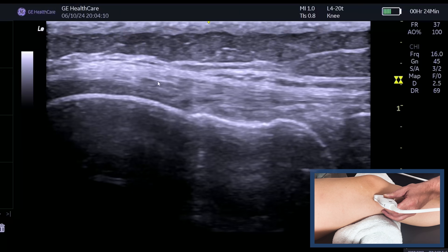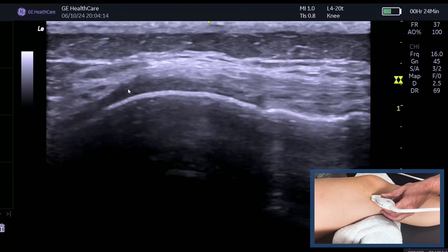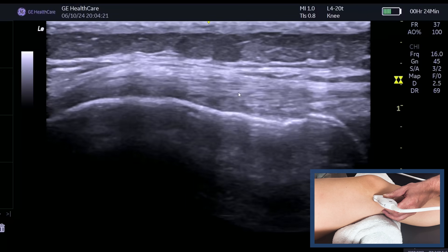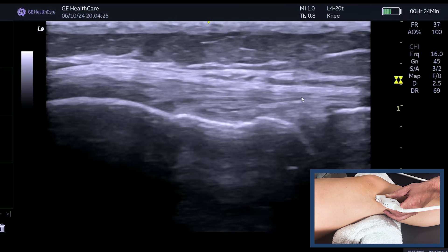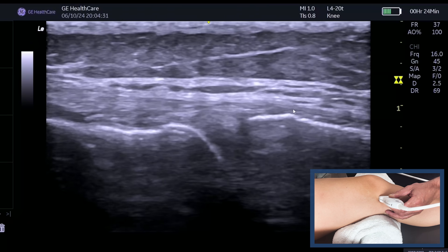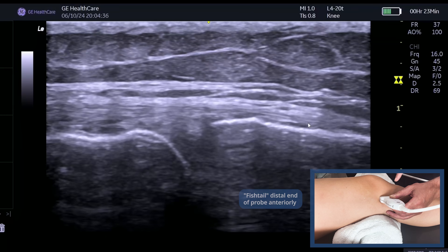The superficial band goes over the top and really grabs the femoral condyle. You can see that lovely fibrillar pattern, and you can follow the superficial band over the top of the medial meniscus. This is the superficial band, this is the medial meniscus, and we can follow that lovely fibrillar pattern distally.